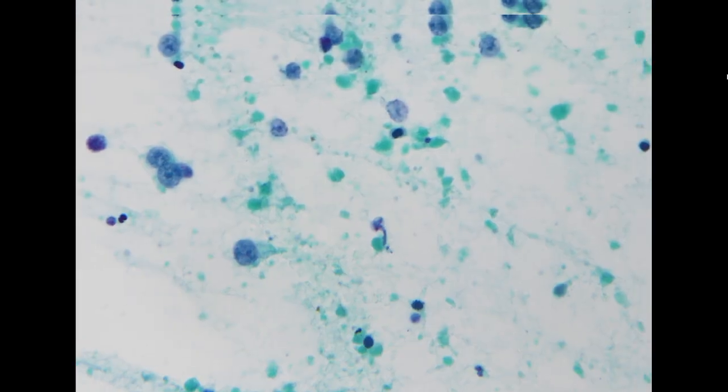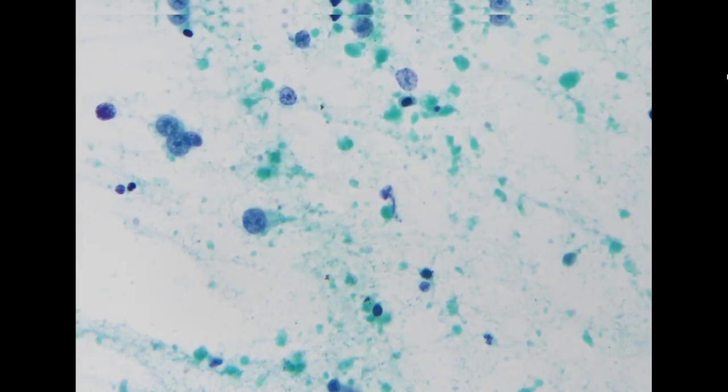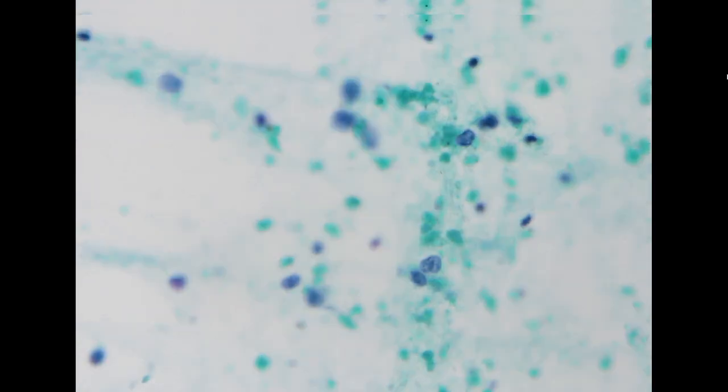So we would sign out the case as a non-small cell carcinoma, and we will address that the patient does have a history of breast cancer. The patient also had a concurrent biopsy, so they will do the lineage marker on the biopsy specimen.